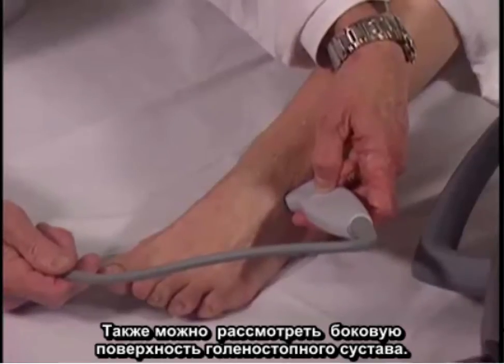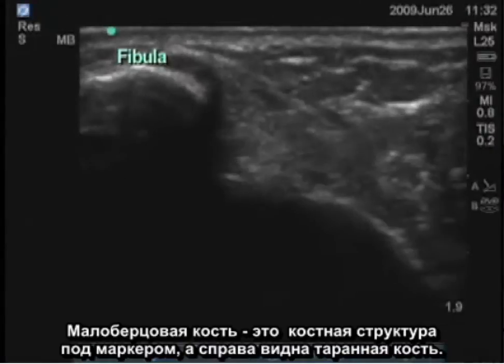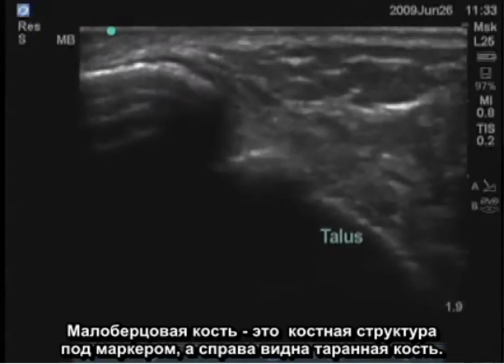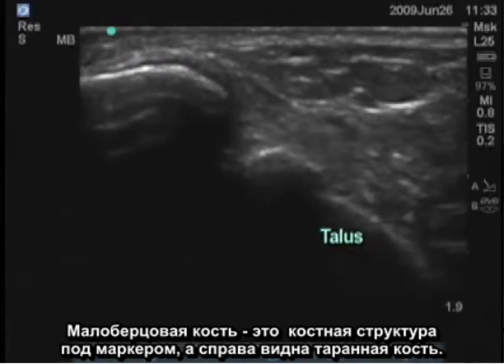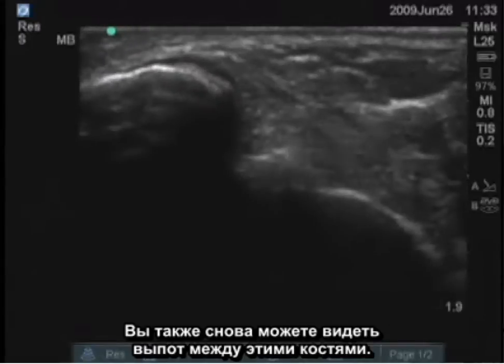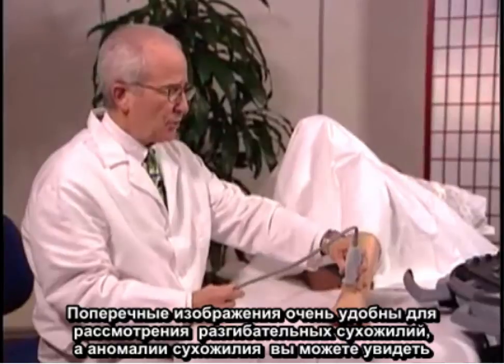The lateral aspect of the ankle joint can also be examined. The fibula is the bony structure underneath the marker and the talus is to the right. You can see an effusion again between those bones as well.